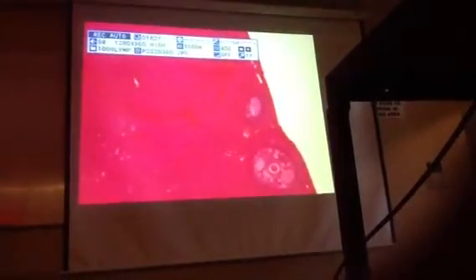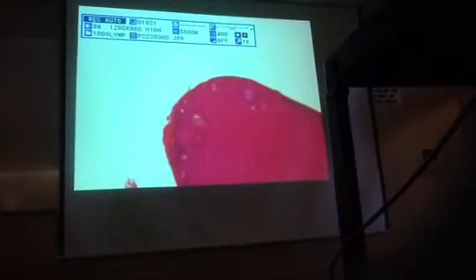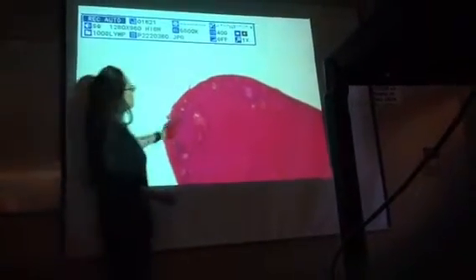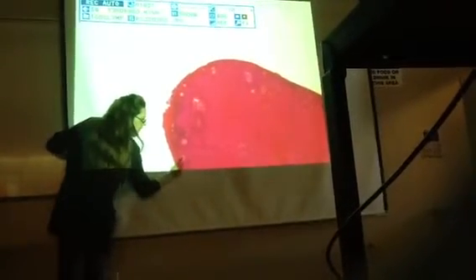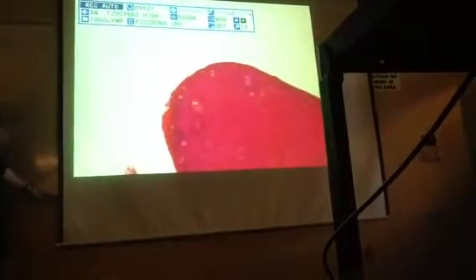Let me find you some other follicles, because they'll be of different sizes. This one's a little bit hard because it's just so dark. But over here we've got some follicles. Here's a small follicle, and right in the middle is an oocyte. That would just be a younger one.